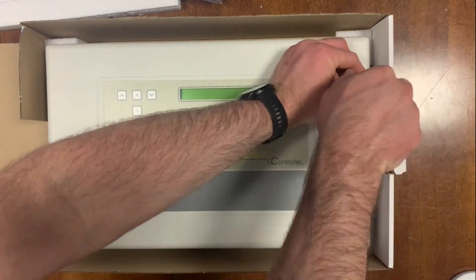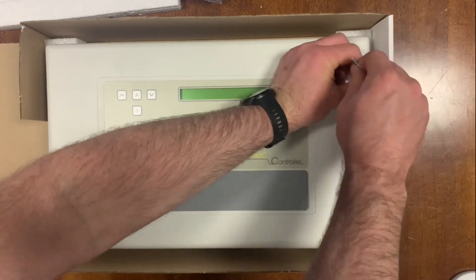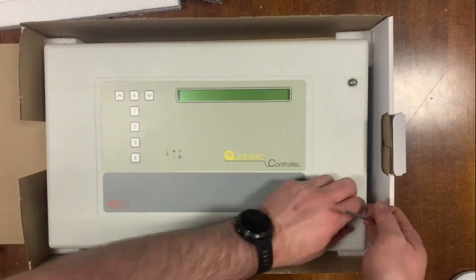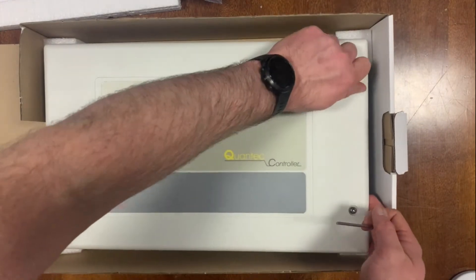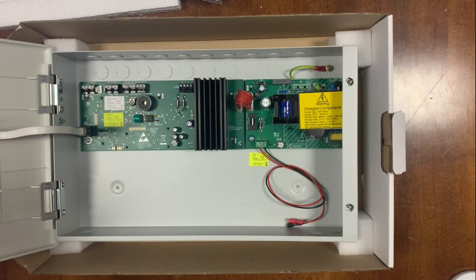There's not actually a huge amount to look at inside this. I'll do another video where I have one that's powered up and I can go through some of the menus and other bits and pieces, but this is just to give you an idea of what's actually in the box.